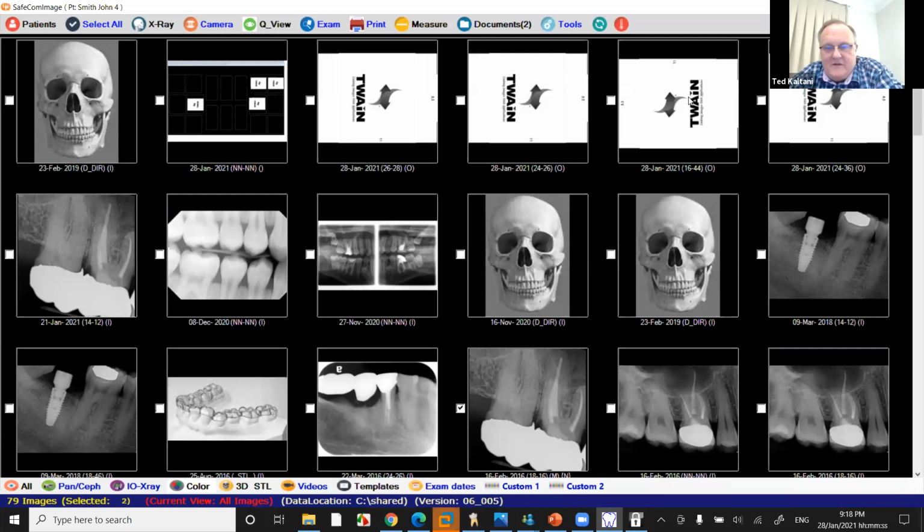Let's say we have offices that are using different management software. For them to exchange, let's say, patient files, it's somewhat difficult because you have to choose maybe Dropbox or this and that, and then you have to question: do I really have the full privacy covered when I use a third party like Dropbox or not? Because first, where are the servers located? Are they located in Canada or not? Which is a privacy issue. Two, are the files encrypted at the source or not?